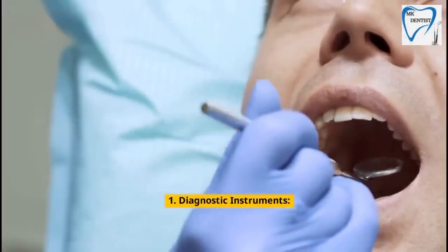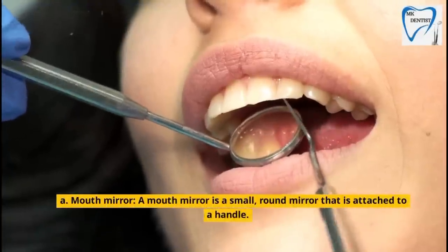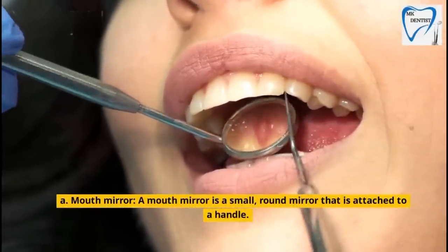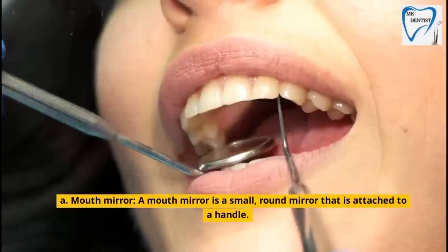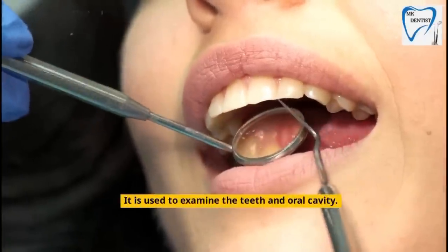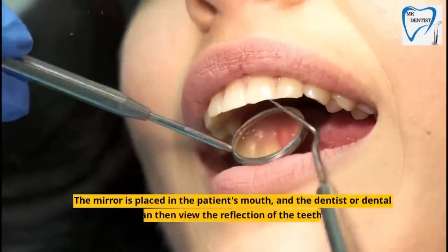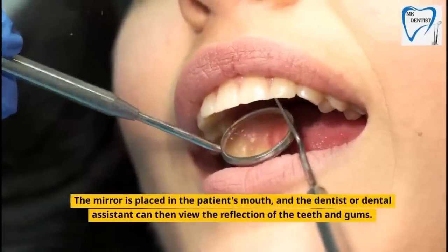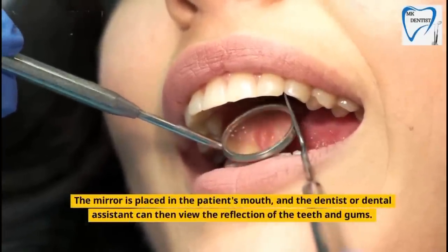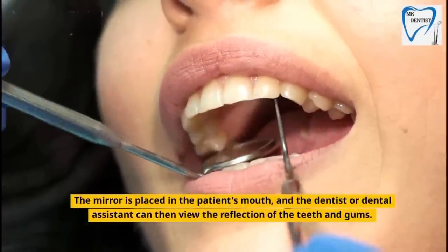Diagnostic Instruments. A. Mouth Mirror — A mouth mirror is a small, round mirror that is attached to a handle. It is used to examine the teeth and oral cavity. The mirror is placed in the patient's mouth, and the dentist or dental assistant can then view the reflection of the teeth and gums.